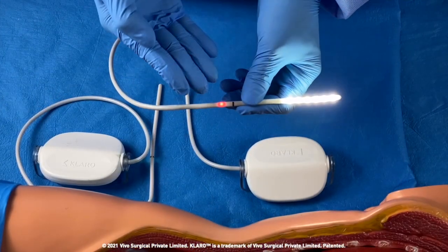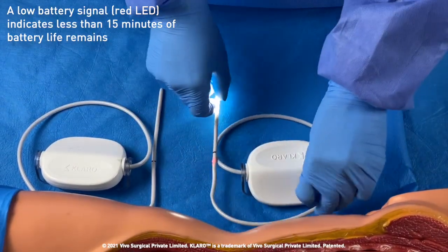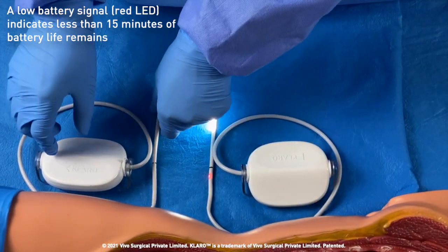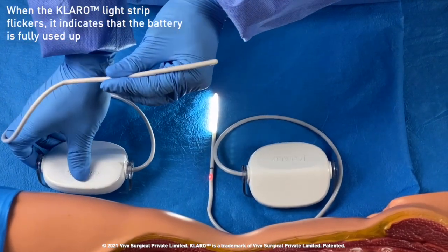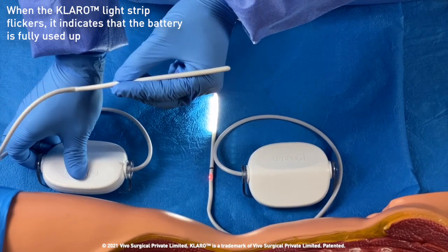Claro has been programmed with a low battery signal in the form of a red LED light that appears when there's 15 minutes of lighting remaining. When the battery is fully used up, clicking the button will cause the LEDs to flicker.